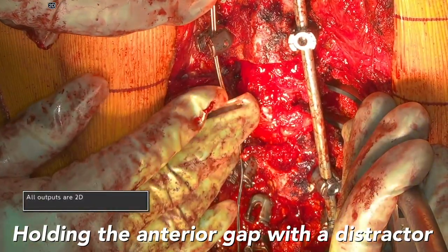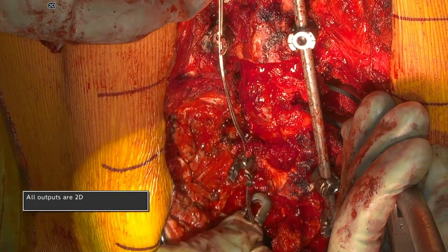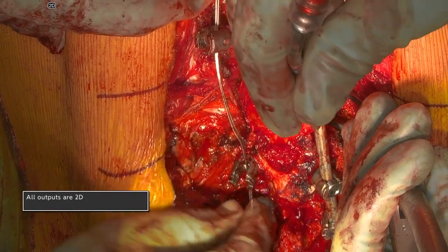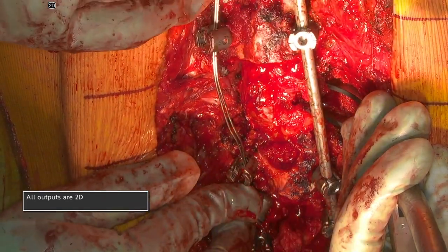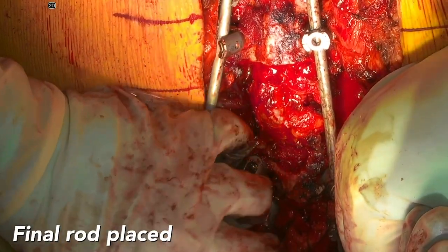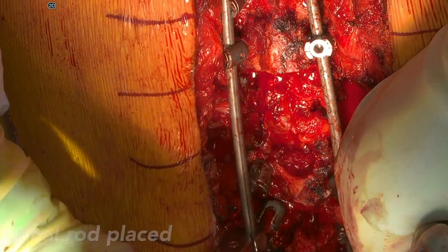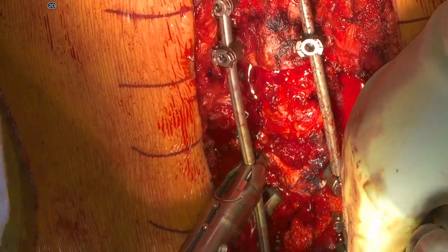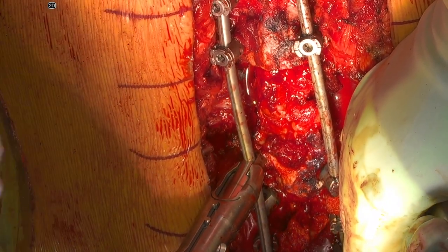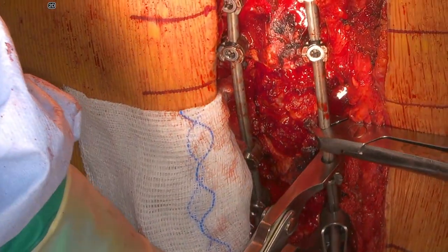Now the final rods are placed. One rod is left intact and additional stability is applied with a distractor holding the two vertebral bodies distracted, providing a more stable construct. The rod on the other side is then cut to size, contoured, and anchored proximally. With cantilever, it is dropped down into the lower part of the construct into the lumbar spine. Additional compression is also applied after replacing the other rod, showing the final correction of the kyphosis.